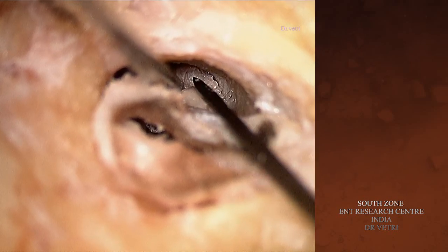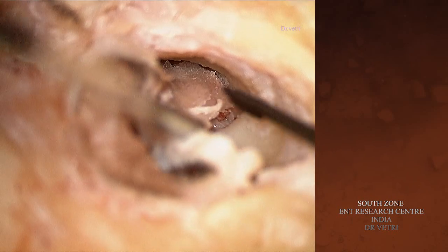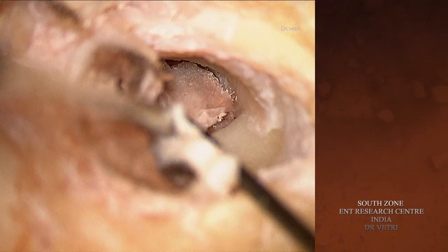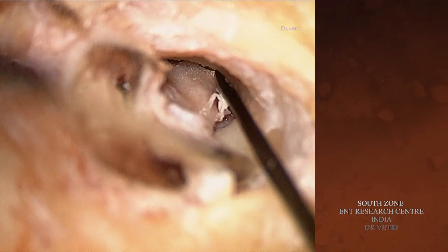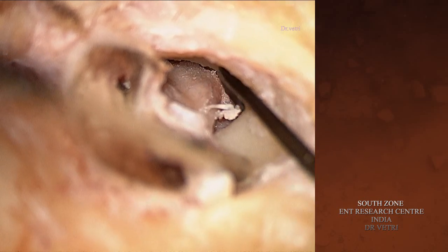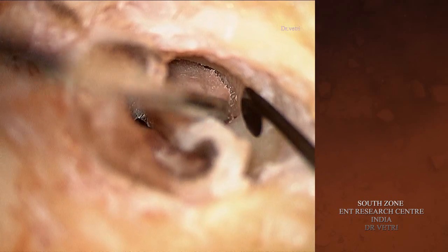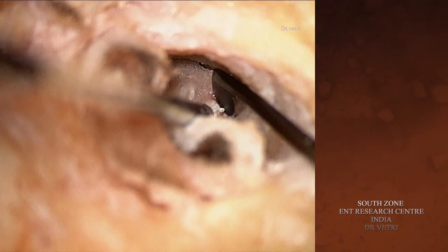See how beautifully the flap is elevated superiorly. The sulcus in the anterior part is partially exposed.